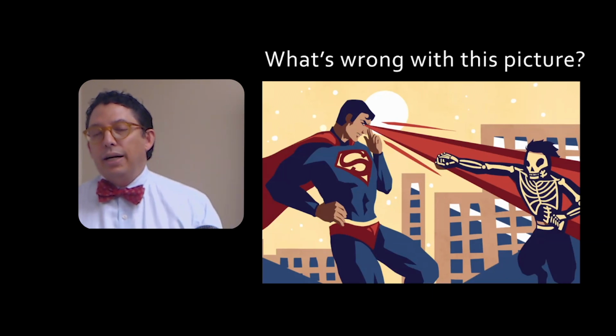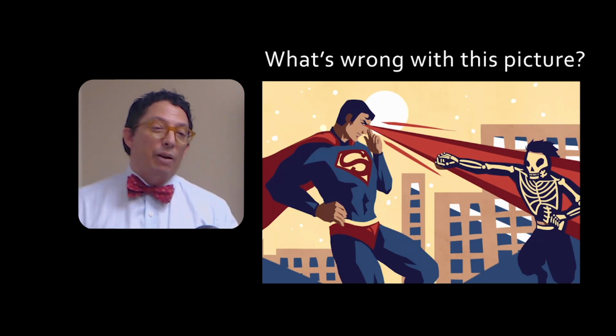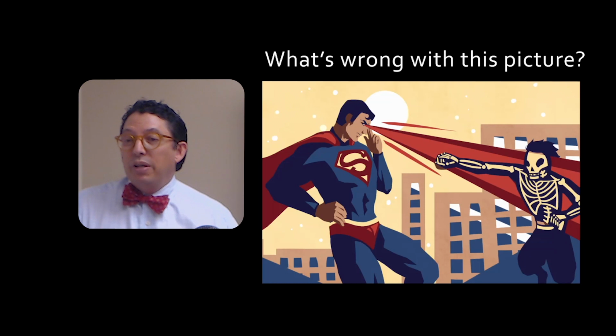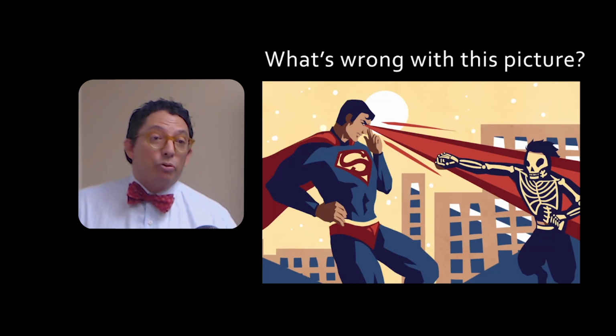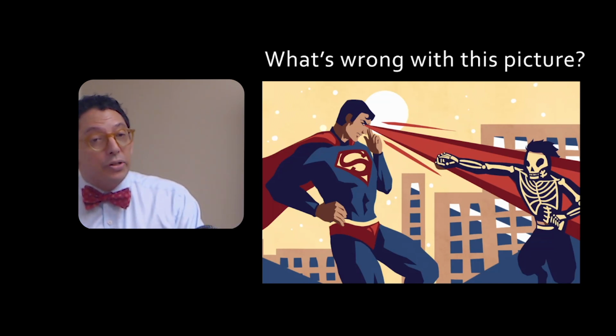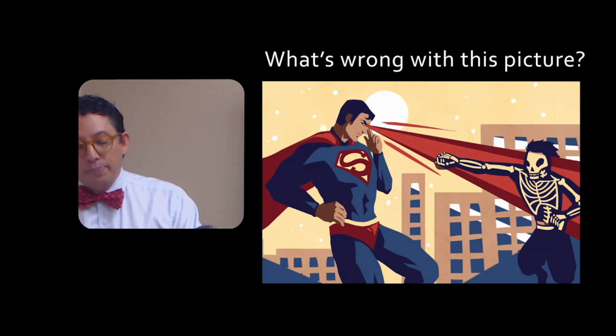Now we don't do that anymore. You see PACS and images on computers that show you exactly the same, because we have changed this analog way of doing images to a more modern way, which is using electronics.